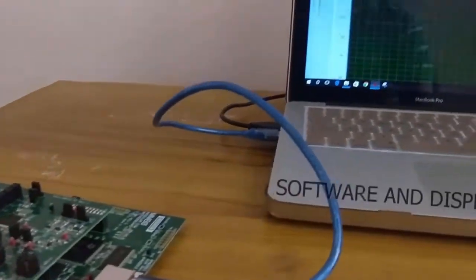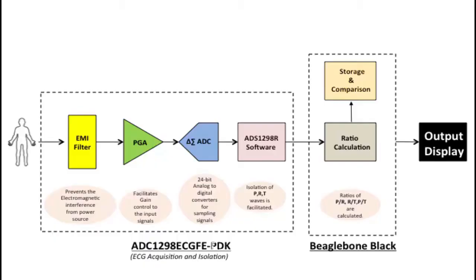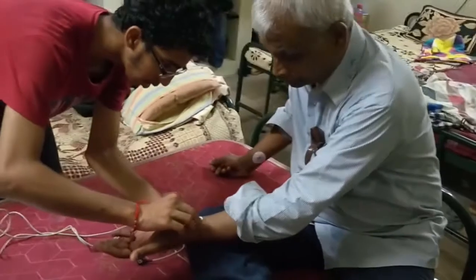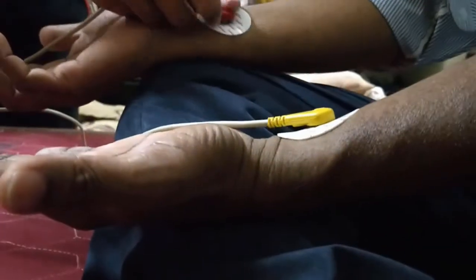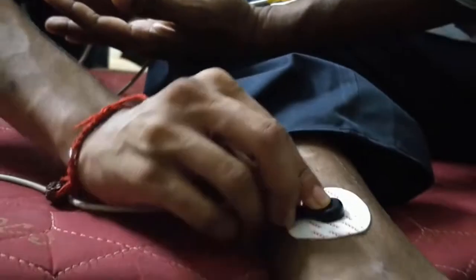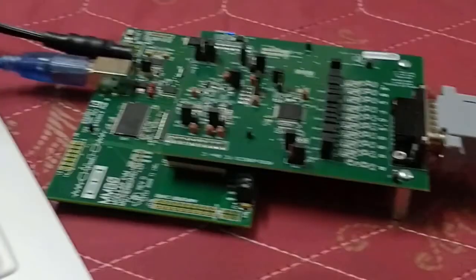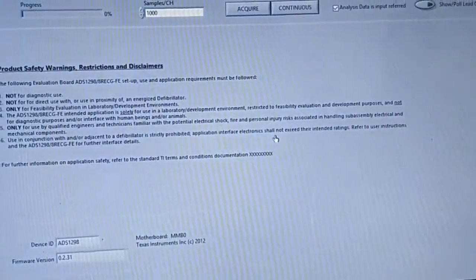Components such as the ADS1298-ECG-FE demonstration kit and the BeagleBone Black microcontroller are used to calculate the fiducial ratios from the acquired ECG signal. Electrode placement as per lead 1 configuration is made, where electrodes are stuck onto the left arm and right arm with the right leg as reference. The lead wire connecting the electrodes to the ADS1298-ECG-FE PDK employs a 15-pin configuration. This is followed by connecting the evaluation module to the PC, where the ADS1298-EVM software recognizes the module.